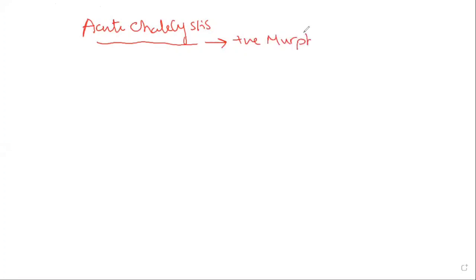Now, what are the acute cholecystitis main signs by ultrasound? Of course, first the positive ultrasonographic Murphy sign: tenderness elicited by the probe. Okay, what else? That has started the whole story: the impacted stone at the neck. As we have said, it might not be impacted, just the stone is present. It might have moved, but usually the impacted stone at the neck or the cystic duct starts the whole sequence.